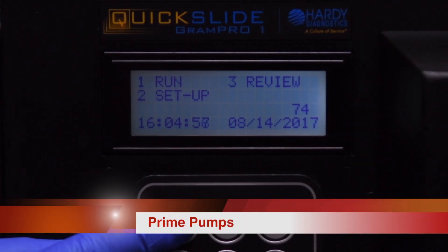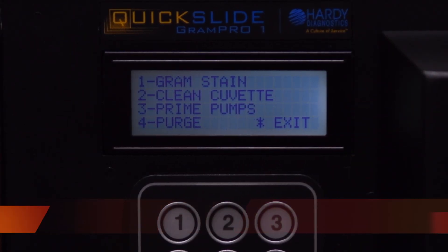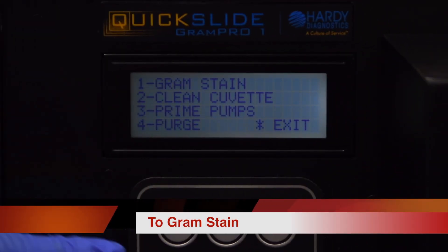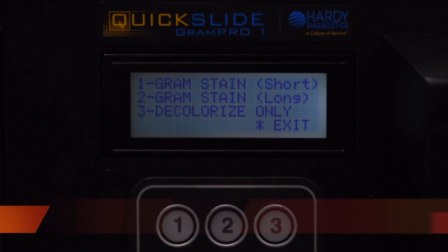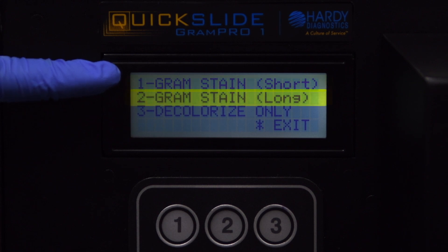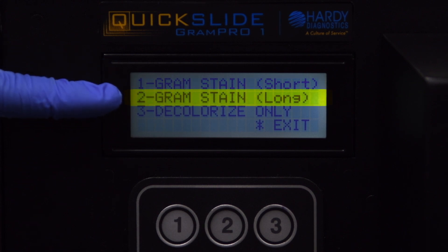Press 1 on the keypad to select the Run menu. Press 3 on the keypad to select Prime Pumps. Press 1 again to select GramStain. Then press 1 to select GramStain Short or press 2 to select GramStain Long.